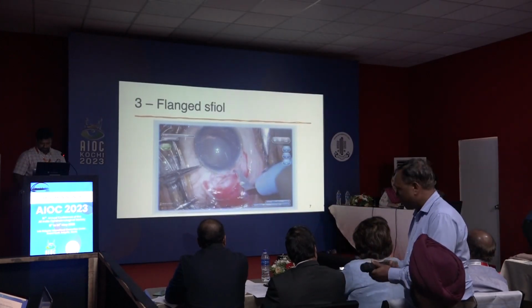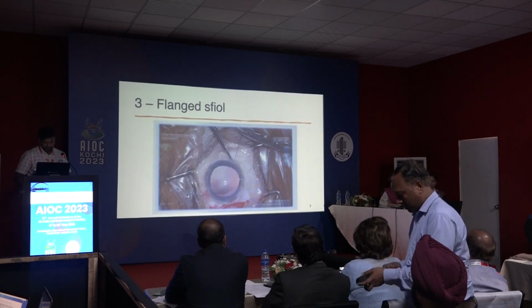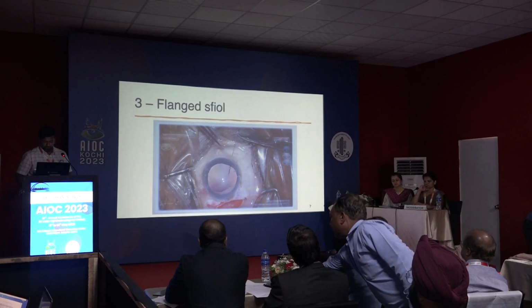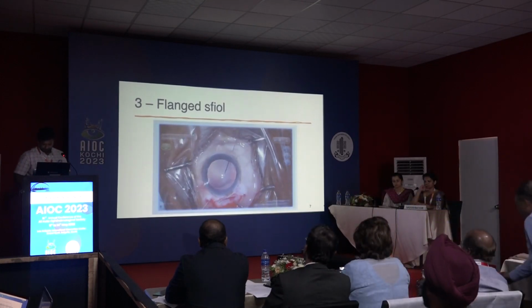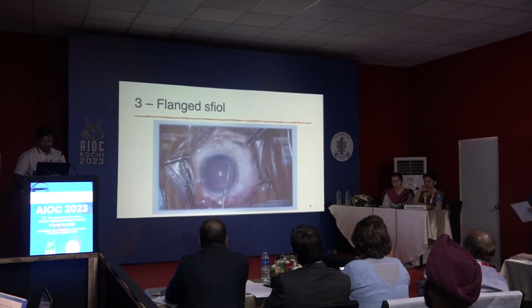So the third indication is where we do a scleral fixated lens. It's similar, where a deep anterior vitrectomy is done after nucleus delivery. The needle is passed on either side. It is exteriorized.